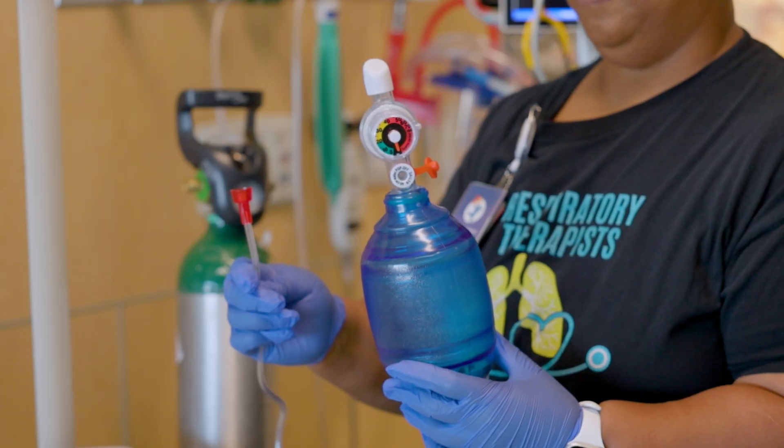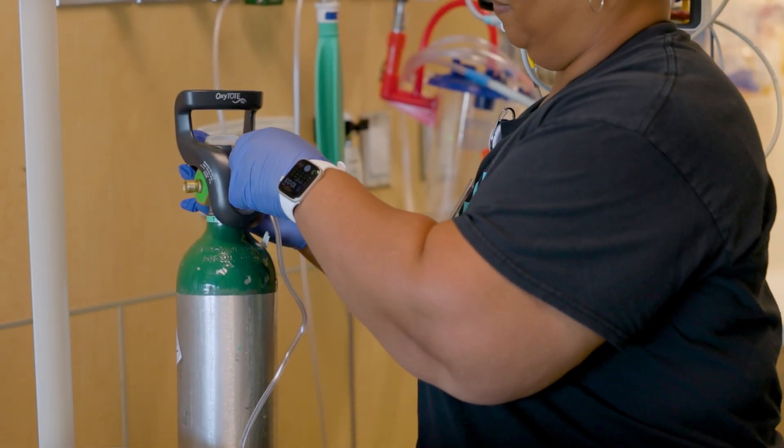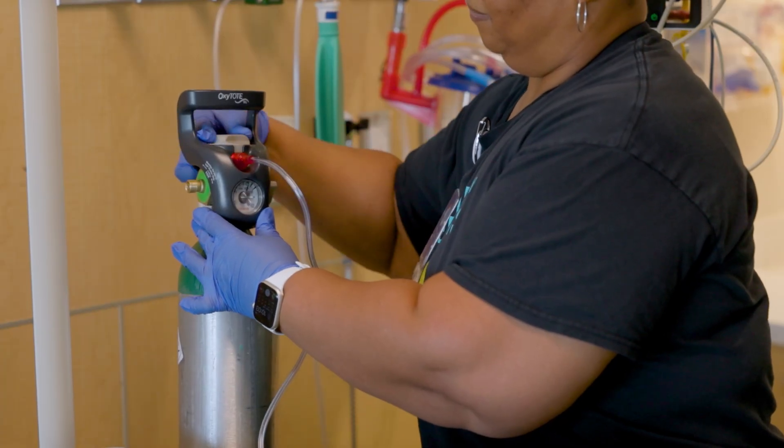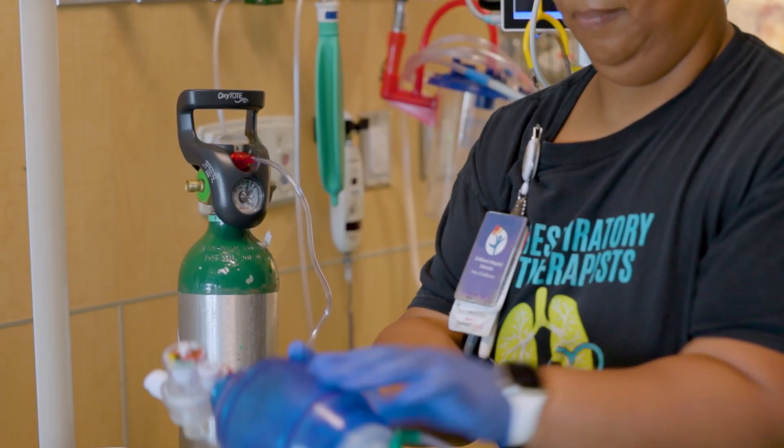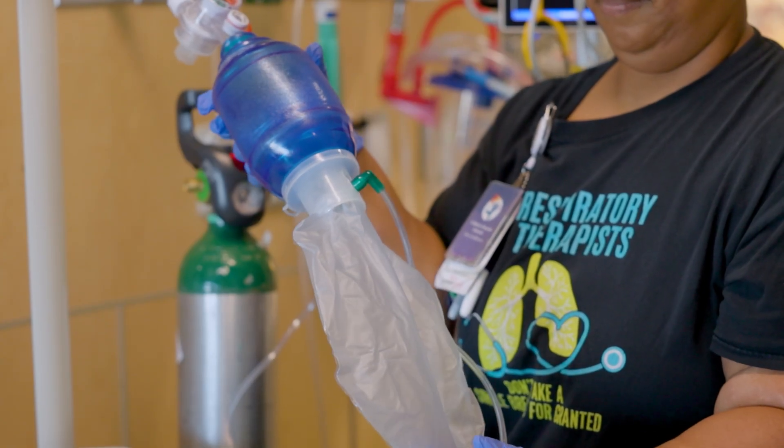To give rescue breaths, connect the oxygen tubing from the self-inflating bag to the oxygen tank and turn the oxygen tank up as high as it can go. If oxygen is not available, you can still use the self-inflating bag without oxygen.